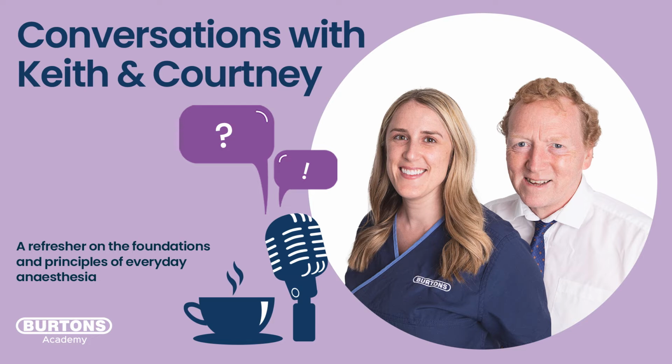So if you're looking at an end-tidal CO2 of 40 millimeters of mercury and a very nice capnogram, during a thoracotomy, and the surgeon pushes his hand down to push the heart out of the way, embarrassing the function of the heart and causing a reduction in cardiac output through the pulmonary artery, then you're going to see a rapid drop in CO2.